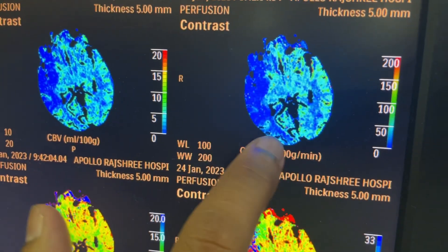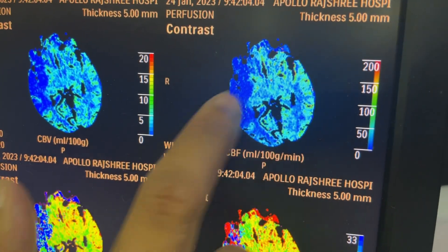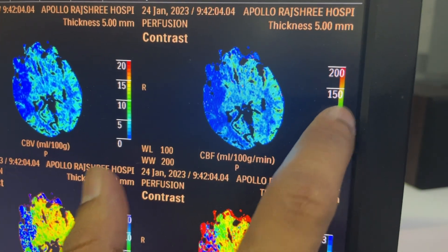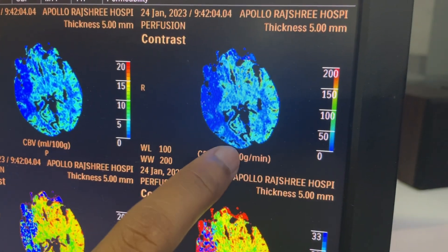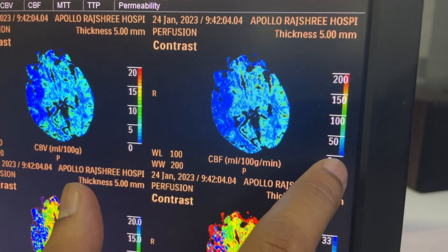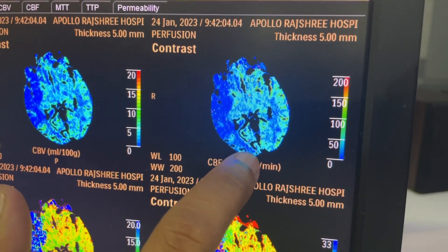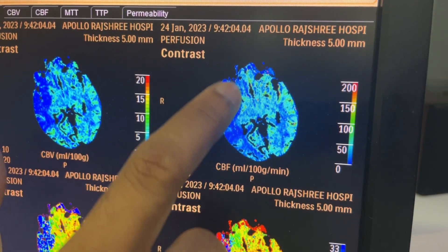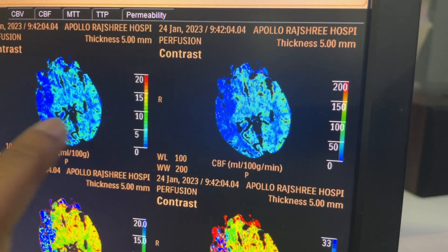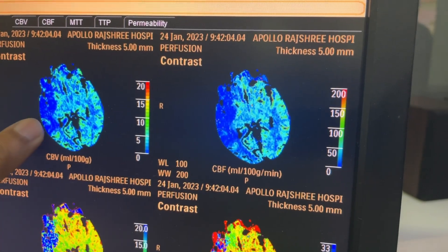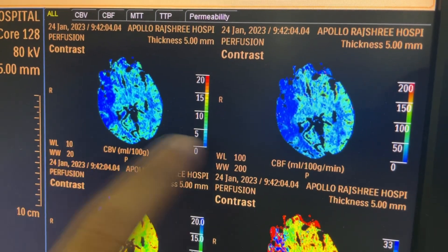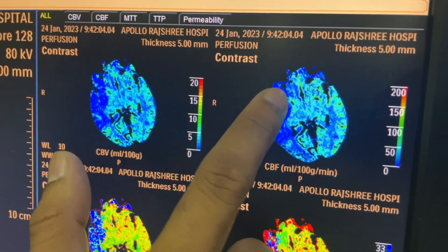Now in CBF, we are testing the flow. You can see that compared to this part of the brain, the green portion means cerebral blood flow is fine, but this portion of the brain is on the scale of zero — that means cerebral blood flow in this part of the brain is not good. So we have low blood volume and no blood flow in this part of the brain.